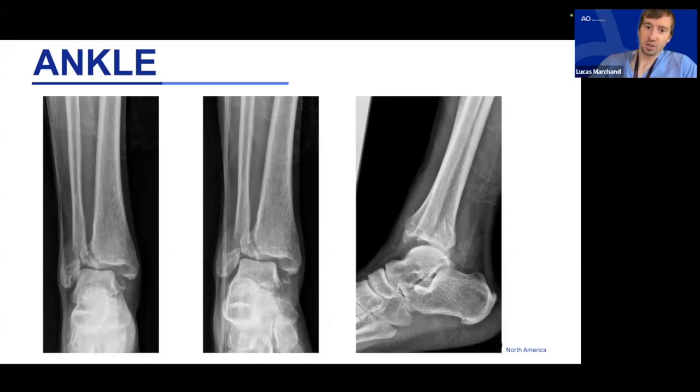Again, she's doing an excellent job of being precise in her description as well as concise. She's describing the displacement of the fracture by the distal segment as well as the displacement of the subluxation or dislocation. And I think we'll just take a quick break and let Dr. Kellum tell us the difference between subluxation and dislocation.